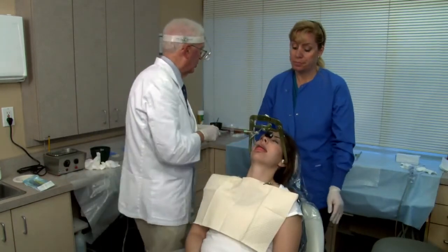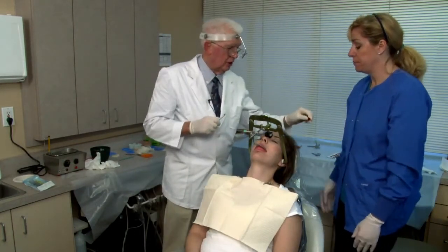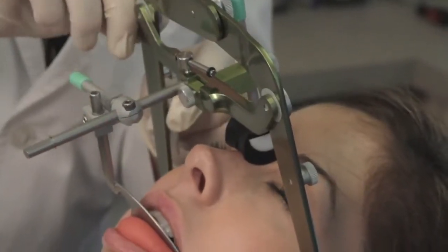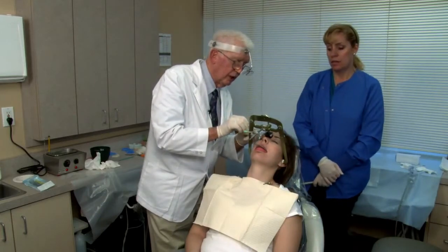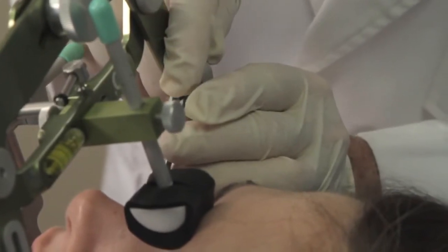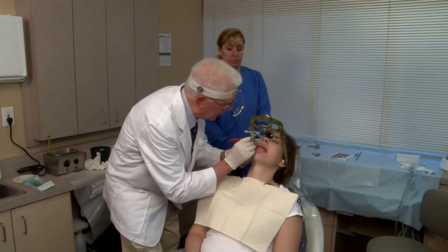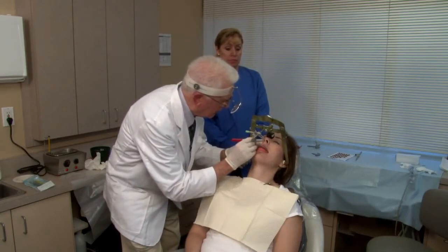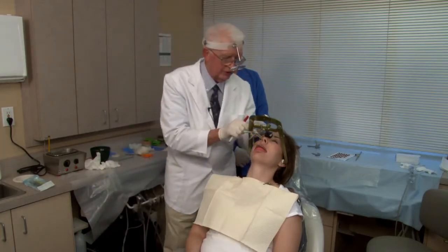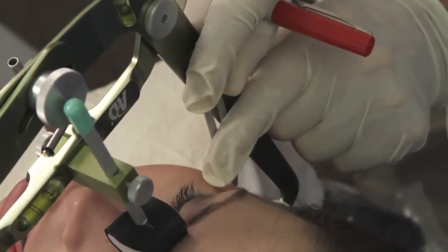Now we have to do the marking of orbitale and the three points I need. So we'll loosen the orbital pointer and move it over and put it directly under the inner canthus of the eye. Touch the skin. I can pull down on the cheek, put a dot there and let go, and it goes right up underneath the orbital pointer. So this is registering the same vertical dimension as orbitale.